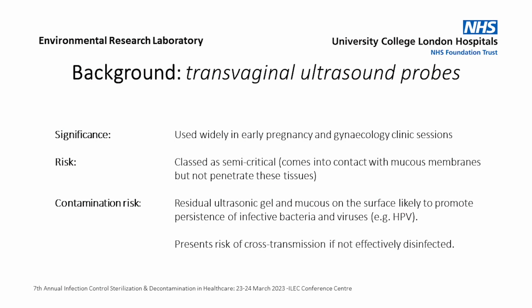So we know that the transvaginal ultrasound probes are used very widely in gynecology clinic sessions, and because they are used and come into contact with mucous membranes, there's a risk of either biological fluids or products or mucus residing on these surfaces, and that then has an impact on how well these surfaces can be decontaminated.